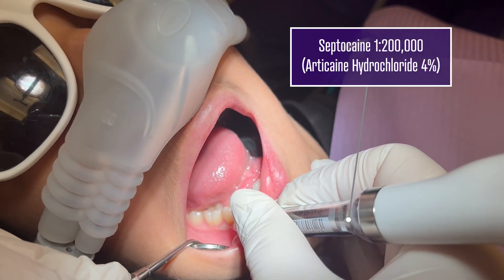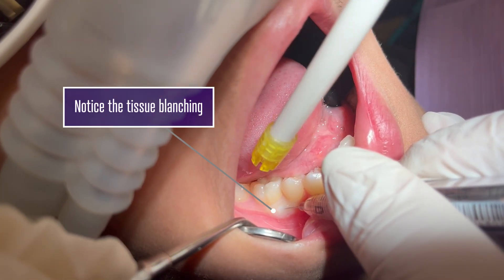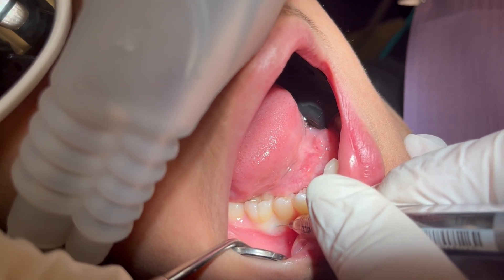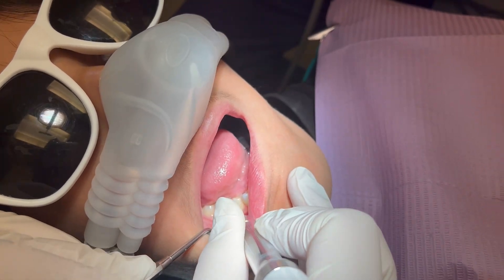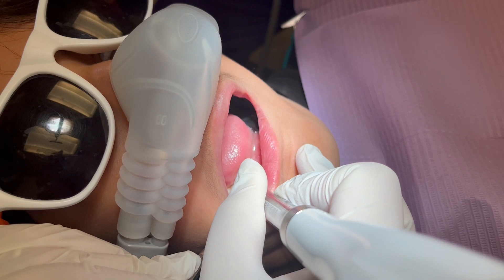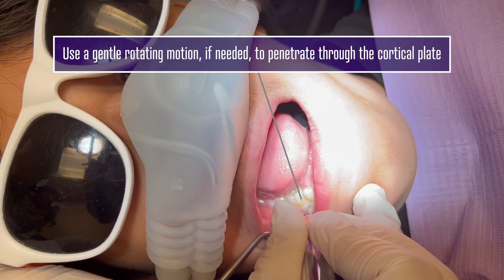See the tissues starting to blanch? You're a good model. So now that's nice and blanched. I'm going to change my angle, so I just need you to back up a little bit. It just sinks right in there — wiggle, wiggle.